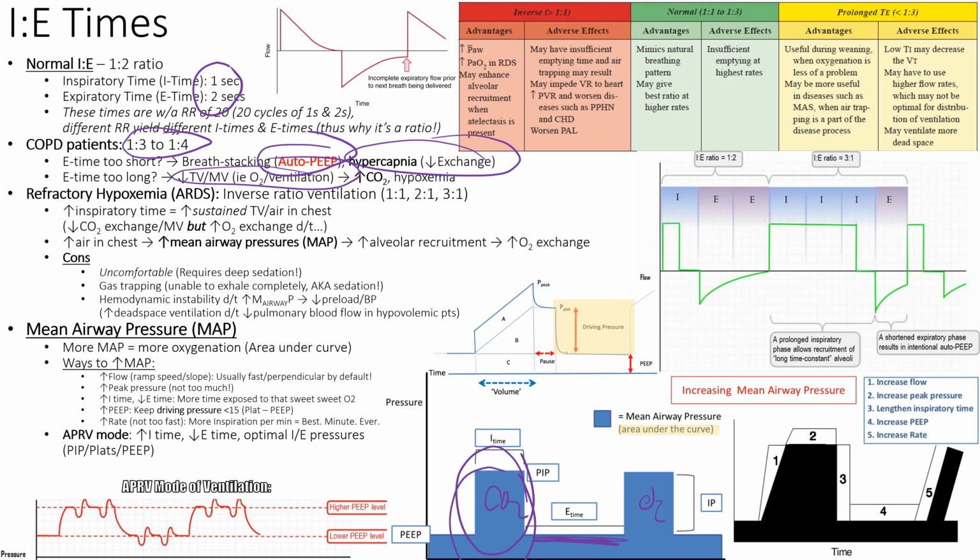Okay, when you start getting to ARDS territory, which we can go to in the next section, we have refractory hypoxemia. What does refractory mean? It just won't go away. Like refractory pain is pain that's still there after pain medication. So it's hypoxemia that's still there after doing all the tricks. We raise the PEEP, we raise the FiO2. What other things can I add to my tool bag? So this is what we can do here, right?